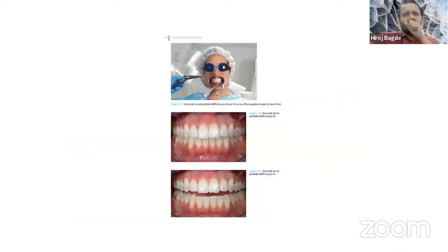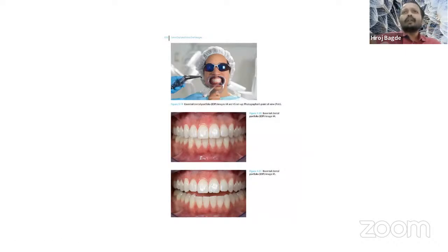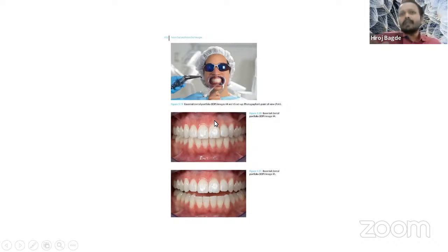After this, we are going to have drying of this area. We are going to take off the saliva from that area. We are going to have a smooth flow of air so there are no salivary droplets or water droplets — a very clean field. This image is again taken by DSLR and twin flash system, giving a very clean image.